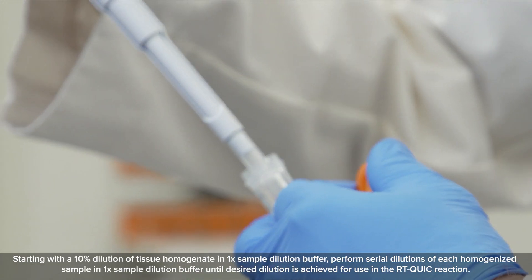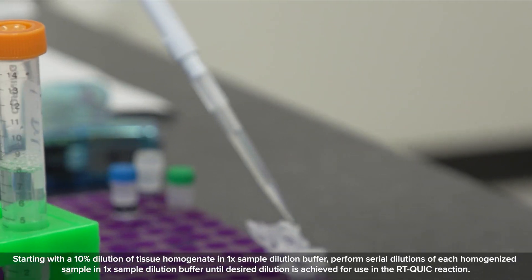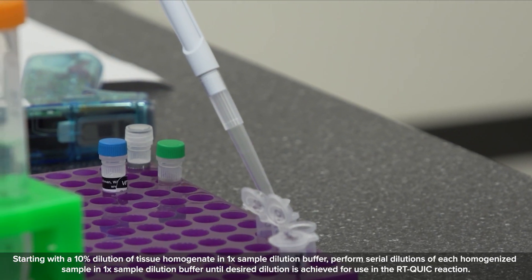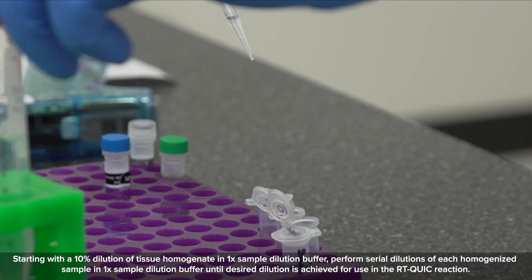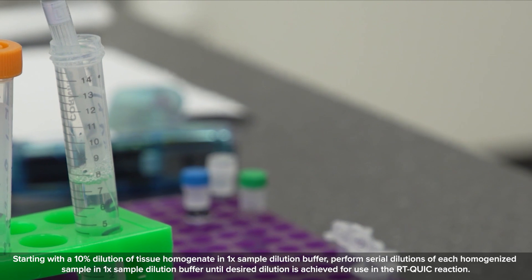Starting with a 10% dilution of tissue homogenate in 1x sample dilution buffer, perform serial dilutions of each homogenized sample in 1x sample dilution buffer until the desired dilution is achieved for use in the RT-QUIC reaction.